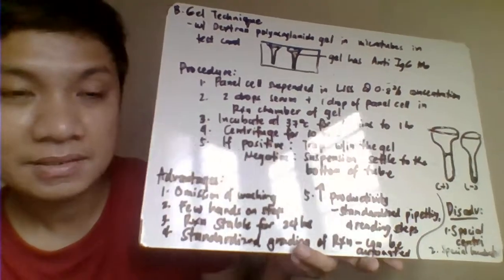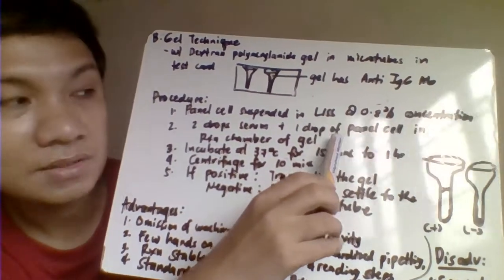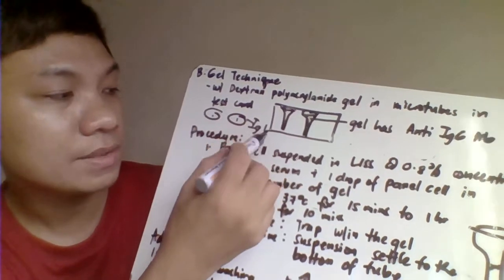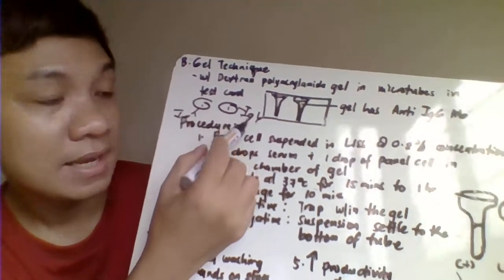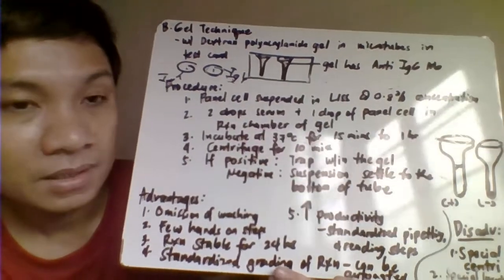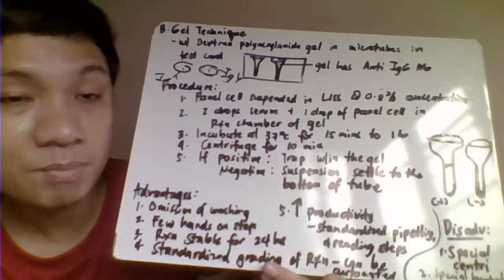So, pag centrifugation, incubation at 37 degrees Celsius, kung ang serum natin may antibody directed towards your panel cell na antigen, so magkakaroon ng antigen-antibody complex. Kung itong red cell mo na panel cell, pag may IgG antibody ka dito sa serum ng patient, so magkakaroon sila ng ganyan. Okay, IgG antigen mo na red cell na panel, and we have your IgG na antibody from the patient sample. Okay, then after centrifugation, you try to observe what is going to happen with your red cell suspension.